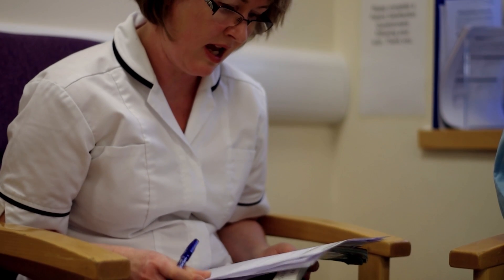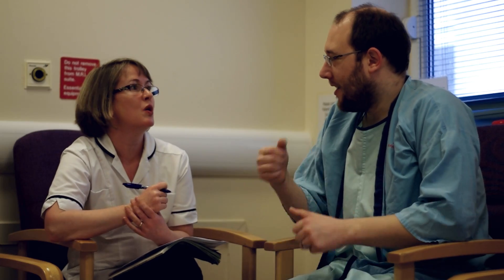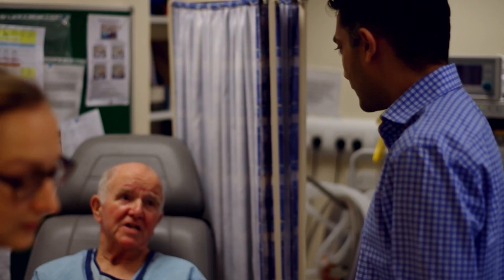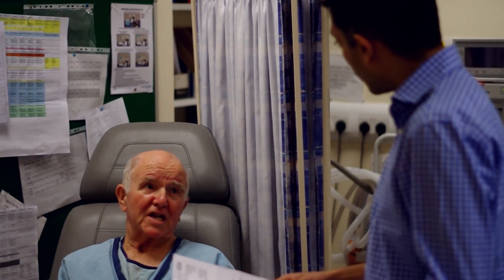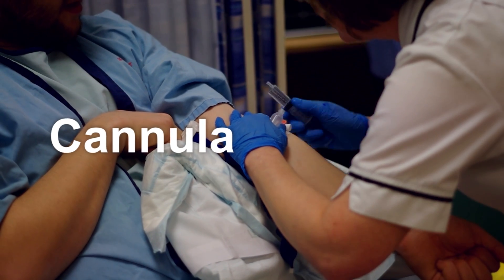Before your scan you'll be asked to change into a hospital gown and the radiographers will run through a safety checklist to make sure it's safe to give you the dye and to make sure you don't have any pacemakers, metal implants, or foreign bodies. This is really important for safety — please let them know if you have any of these or if you've ever been injured by a metal foreign body such as shrapnel.